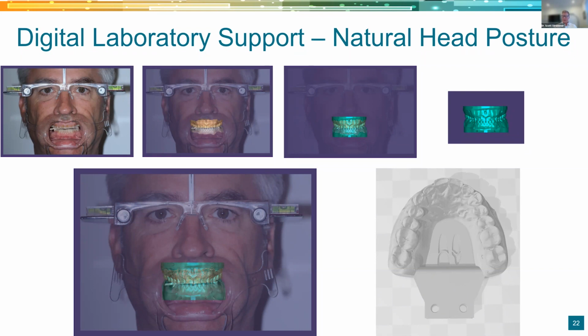We call it flat on the platform. You'll see that coming up later. Yes, most of the digital design software has virtual articulators built into them, and they're getting better and better. The challenge is, unless you know where that fits in the patient's face relative to the horizon, you start doing a 14 unit case, a full arch, and it's game over if you've got a slant left to right, or the AP is off, or the midline's got a twist to it.